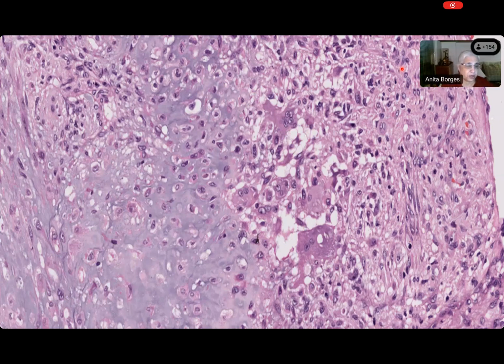Now I'm asking you the question. We have agreed that this is cartilage, but why is it not hyaline cartilage? Monica. Come on, Monica. Because there's no clear zone of transition. Oh dear. Zara, is this not hyaline? Is this not articular cartilage?